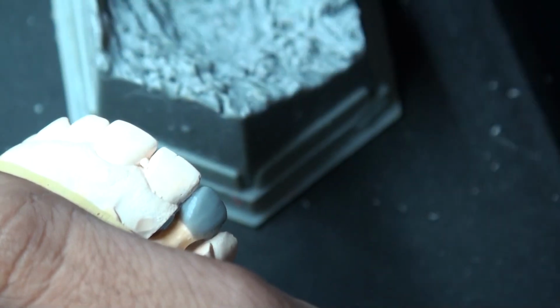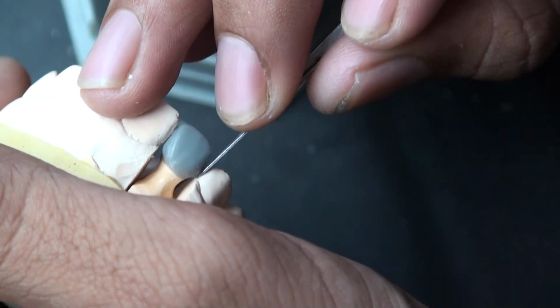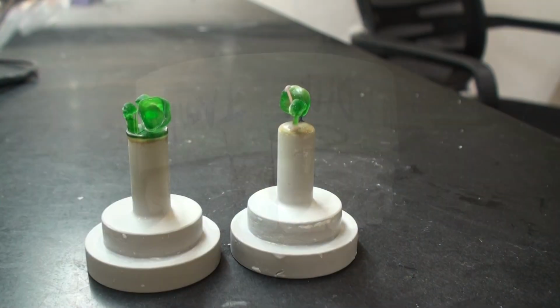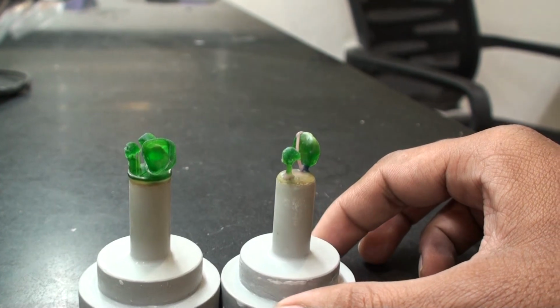This is going to be an Emax crown, a press technique. So this is what we're going to be discussing in the next few steps, how to make a press Emax crown. That's the crown ready. Now let's assume this is our wax pattern and it's going to be invested now.